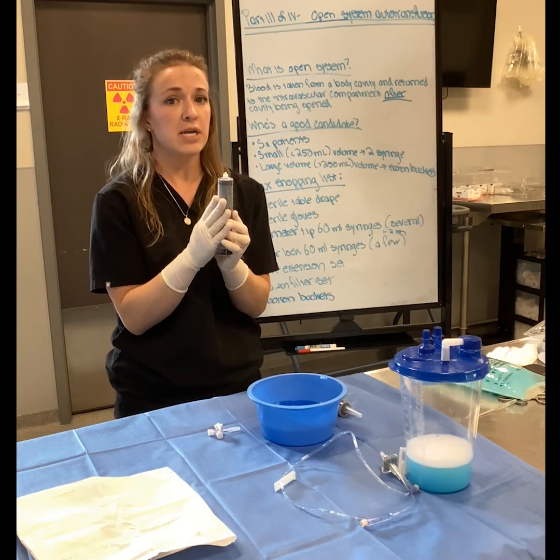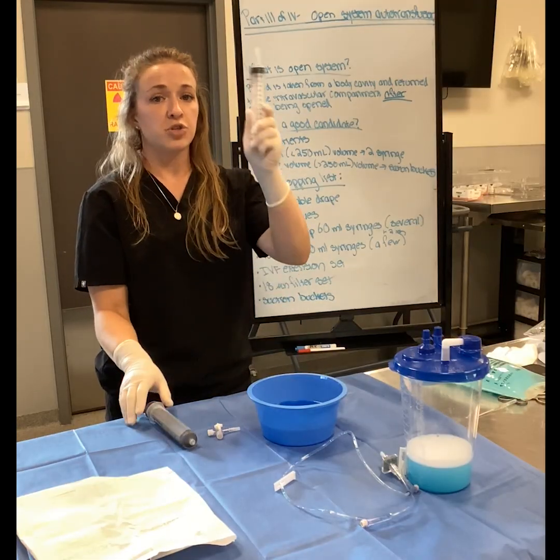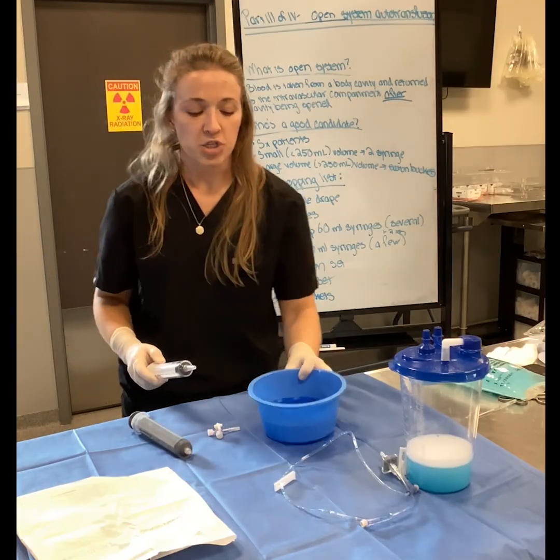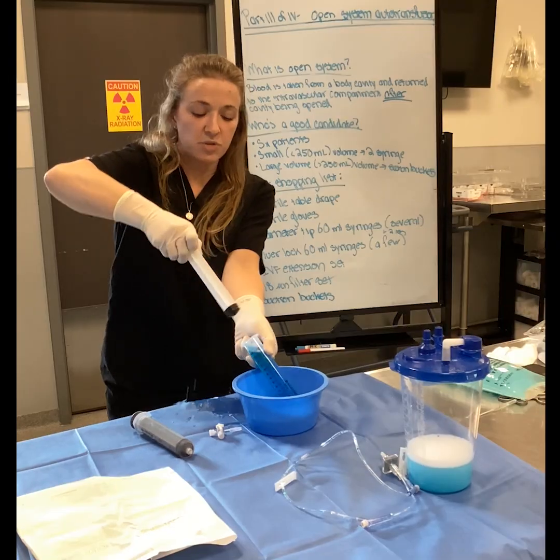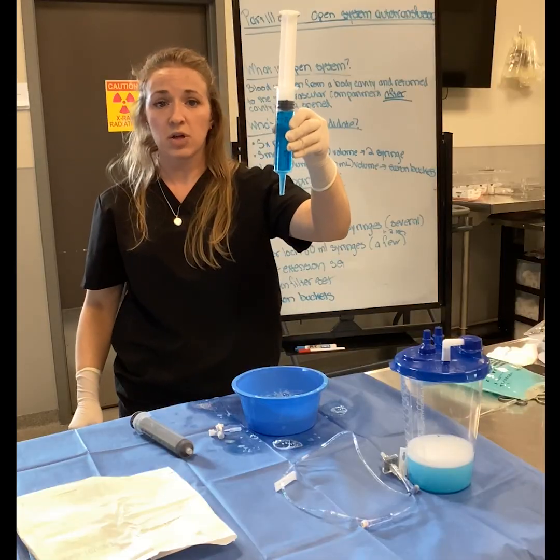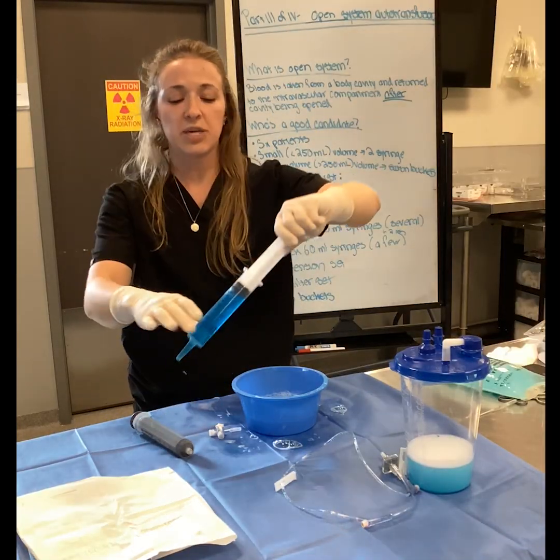I'll reuse these when I take the blood from them, and then the surgeons will throw away this, but you won't throw away this until you're done with the transfusion, if that makes sense. So the surgeon's going to open up the belly or the patient's chest, and they are going to use, sometimes we make a mess, that happens. They are going to use the catheter tip 60 to collect the blood, and they are going to hand it to a gloved assistant, and that's going to be you.